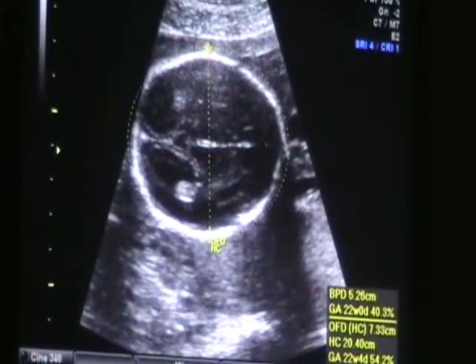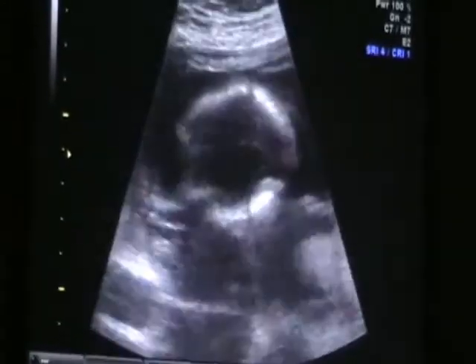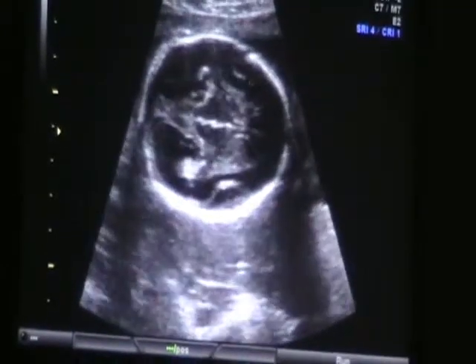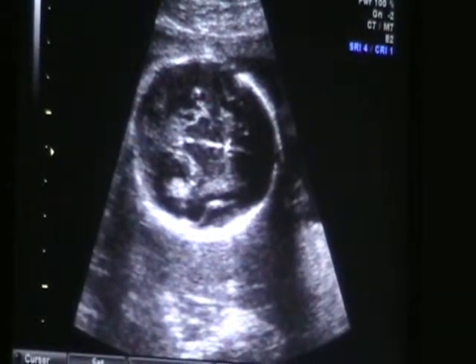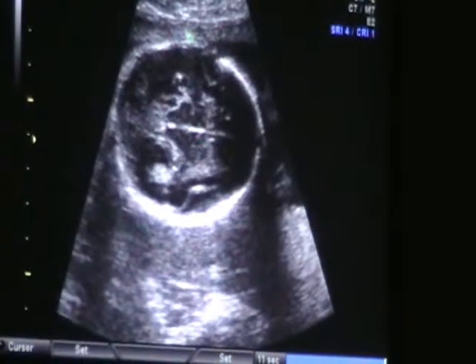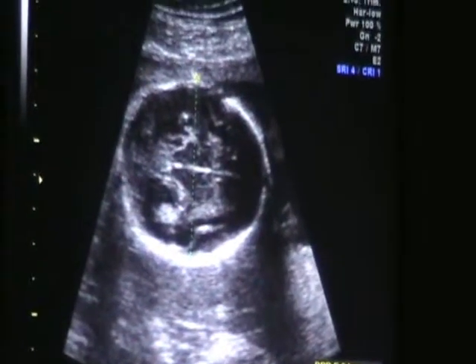And that's all going to help us see how well she's growing. Okay, and we'll do another one because she's a wiggle worm. What's nice is this little thing here — this is called the falx, and it separates the right and left over the brain. So you can see how it looks nice and symmetrical. She has a nice head — we're not worrying about that.